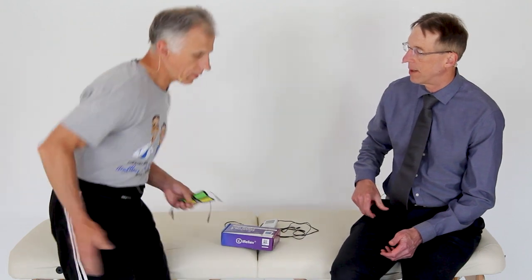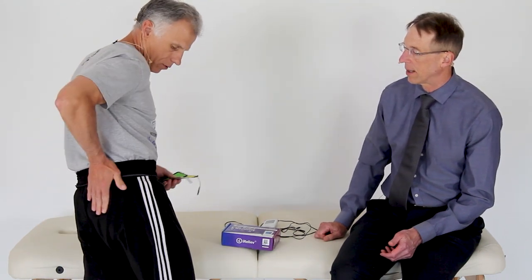Now, we also have mentioned in the past in some of our videos, like let's say the pain is coming from your back into the groin. You could put two pads on your back and two pads on the groin at the same time. Right. So from here to here and to here.